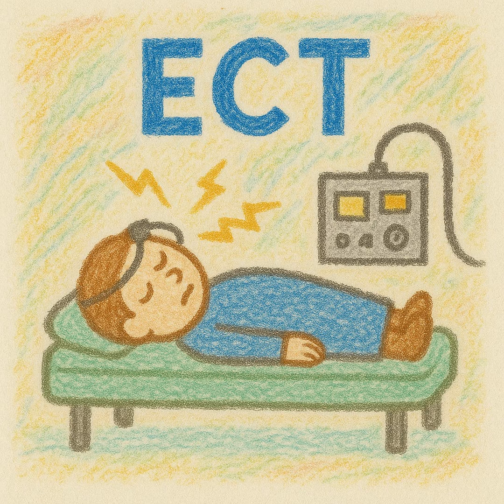The other parameter that we can control is just how long of a stimulus train we're delivering. So we're delivering these pulses, and we can do that for some period of time until we stop. Usually this is going to be a few seconds, so maybe 1 second to a maximum of 8 seconds. The other thing that we can control is the amplitude of each pulse. So basically how tall the pulses are, and this is measured in amps or amperes.